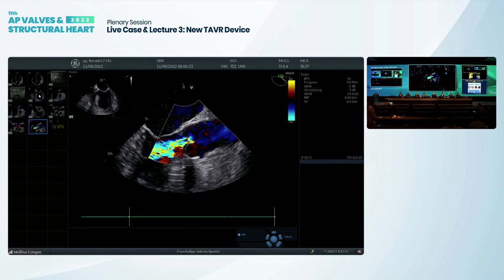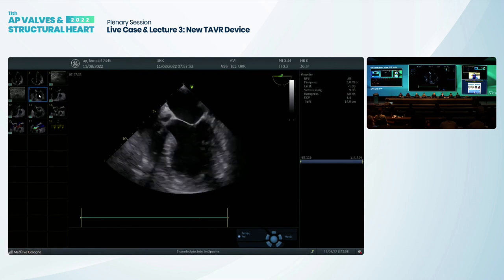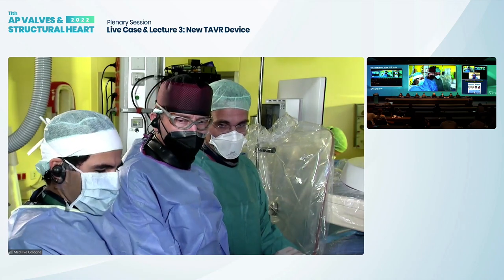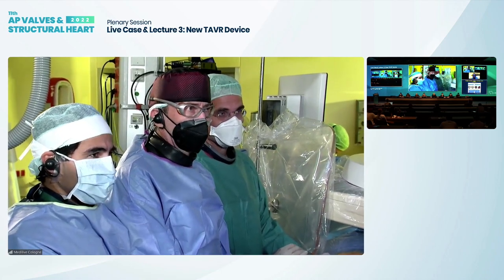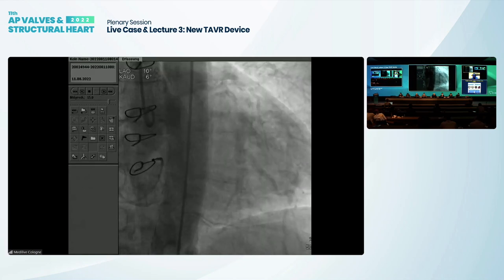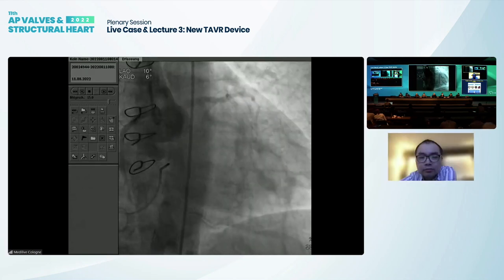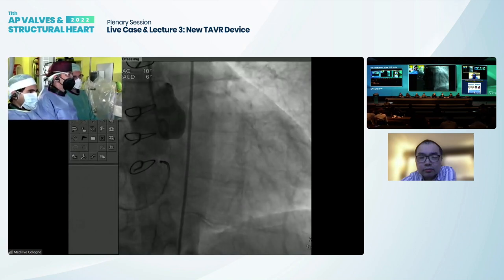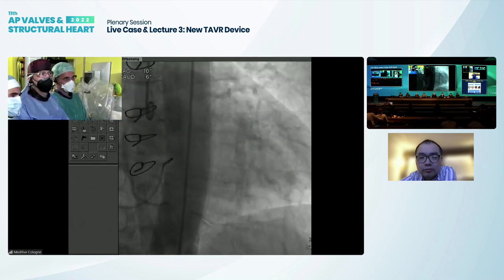And also what we calculated prior in our transthoracic studies is that the left ventricular end-systolic dimension index, that's a very long word, but it is approximately 23. So this also speaks for the clear hemodynamic relevance of the AR in our patient. Okay, and perhaps as a last picture, and then we can discuss the case if you like. We show you the fluoro of our aortic injection of contrast. If you have seen the echo, it may even underestimate severity, but I think you can clearly see that there's entire contrast into the left ventricle when injected in the aorta.